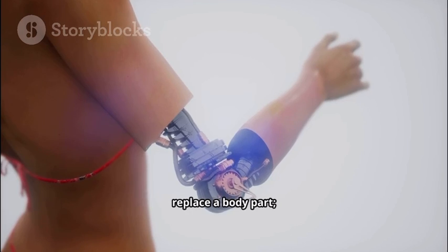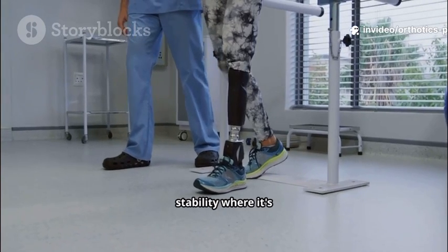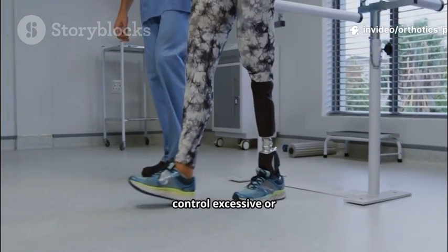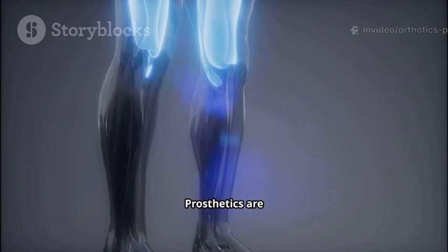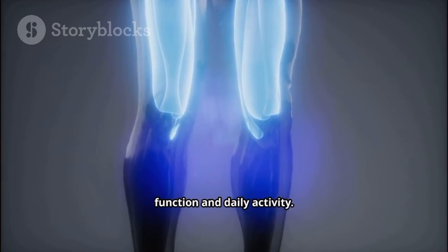These devices don't replace a body part. They assist what's already there. They provide stability where it's lacking or help control excessive or painful motion. Prosthetics are different. They replace a missing part to restore function and daily activity.